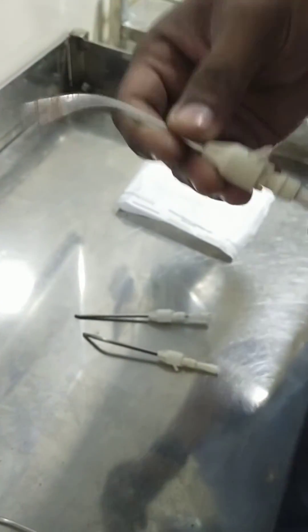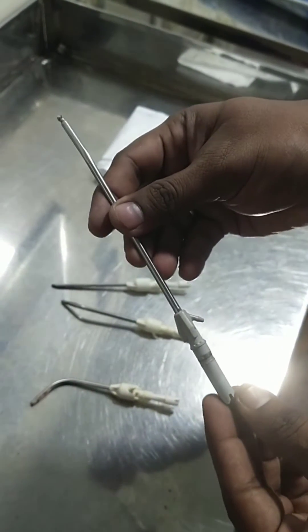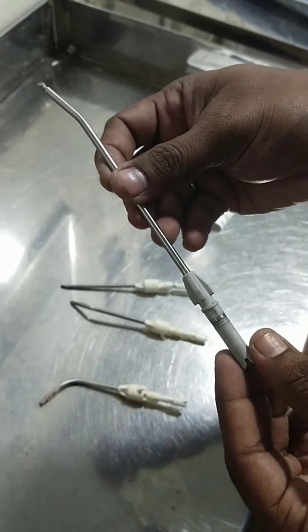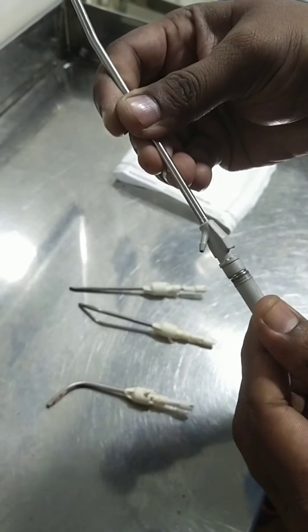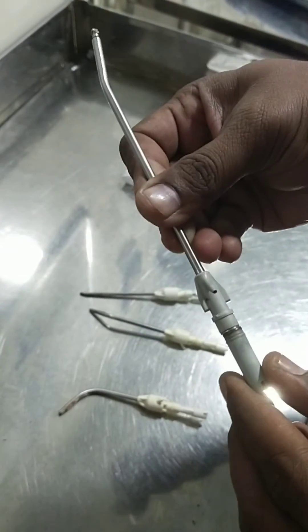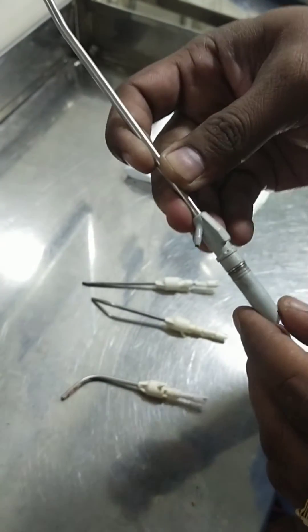It was damaged, so don't re-use this. And this is the high speed bur. This seems to be good but it is a damaged one. How to identify — when you rotate it should rotate, but it is not rotating at all. It is totally jammed inside. So when you re-use this one, definitely the motor will get damaged because it is holding the motor and not allowing it to rotate.